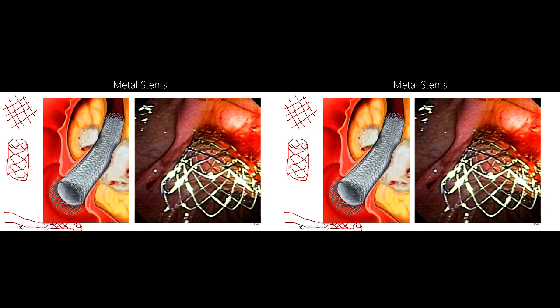Push the stent where it should be, pull the cover off, and it goes poing and goes back to its natural diameter and length. Happy enough? So that's the purpose of a stent. It starts out life as a very, very long, narrow metal tube of chicken wire, and then when it's deployed and the cover is taken off, it shortens and expands out.